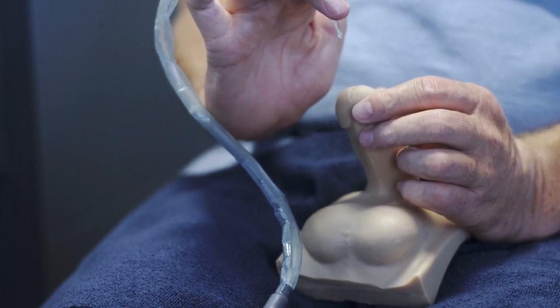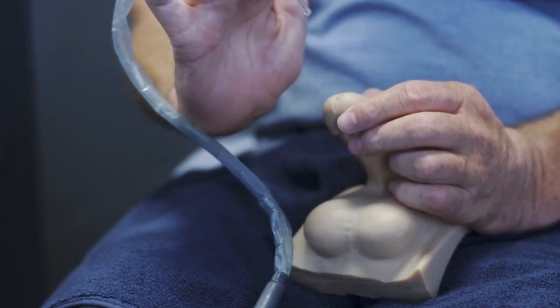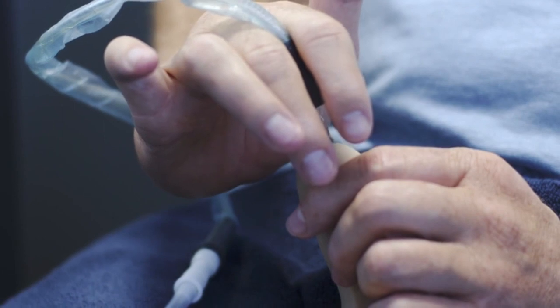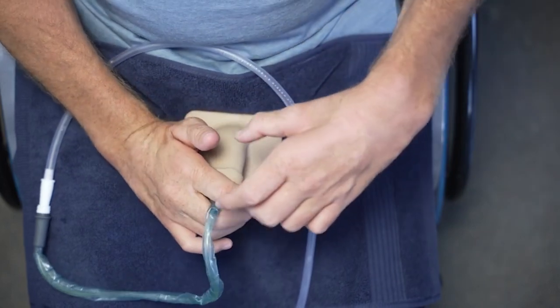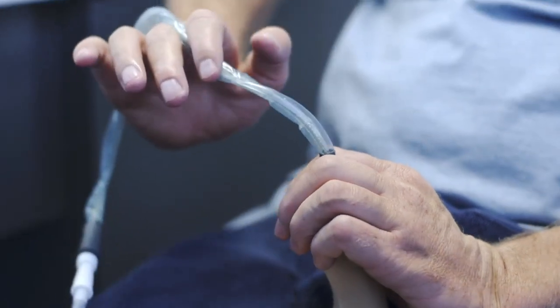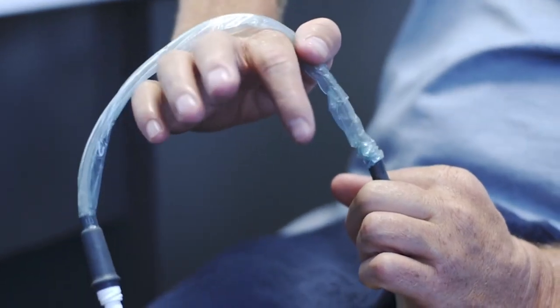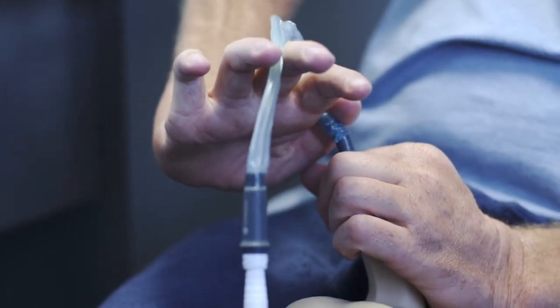If you're a bit nervous, try taking a couple of deep breaths. Being relaxed will make inserting the catheter easier. To control the catheter during insertion, squeeze the soft part of the gray handle. While supporting your penis with your non-dominant hand, use your dominant hand to gently guide the catheter tip into the opening of the urethra. Once it's inside, hold your penis and the gray handle in the same hand without applying pressure to the grip. Use your other hand to insert the catheter. Pinch the sleeve and gradually pull it towards your penis. Pinching the sleeve close to the head of the penis makes the process easier.